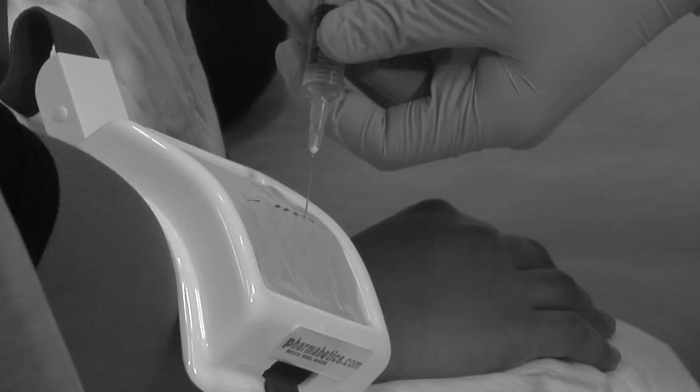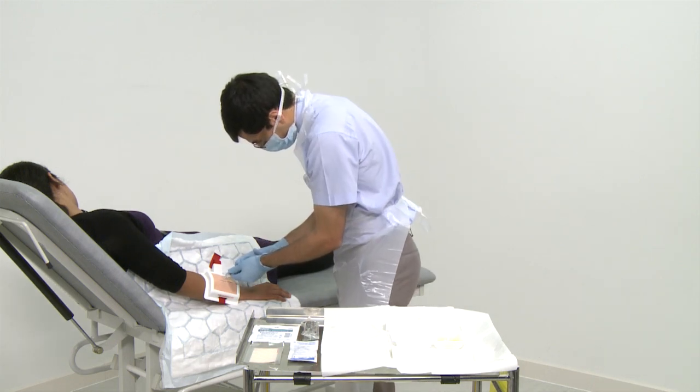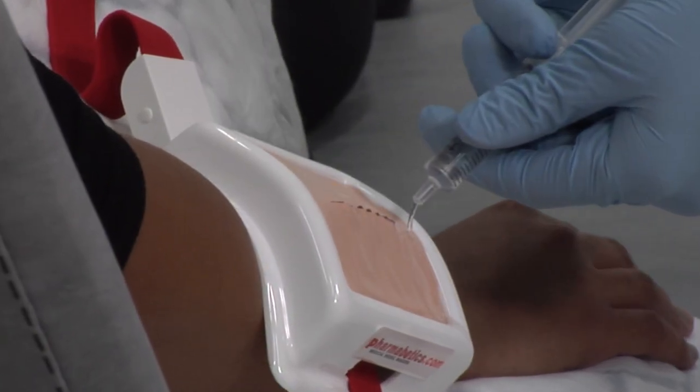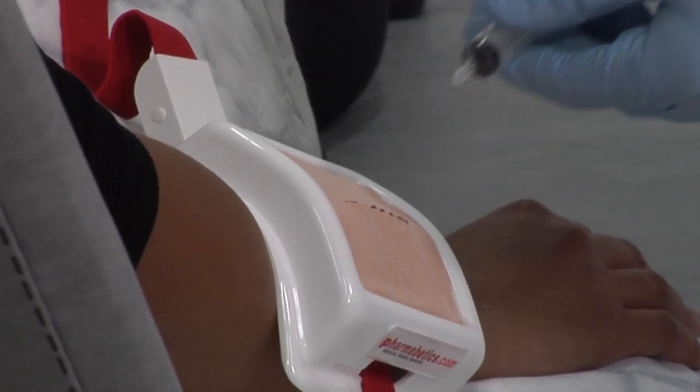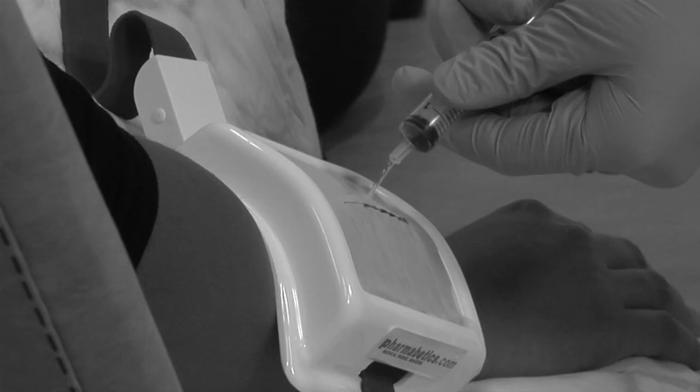The wound can now be explored and cleaned. Meticulous exploration of the wound is essential to determine which structures have been damaged or exposed and to identify foreign bodies. Particulate matter and contamination must be mechanically removed. If dirt is left embedded in the wound, this can lead to infection or a permanent tattooing effect on the skin. Cleaning is performed with high pressure irrigation using a syringe, sterile needle and drinking quality water. Protective eyewear and mask should be worn in case of splashback. The wound can also be cleaned by scrubbing with antiseptic solution and a sterile nail brush. A scalpel should be used to resect any non-viable tissue and to trim the edges of old wounds. Be extremely cautious in areas such as the face, scalp and hands, where skin is at a premium.